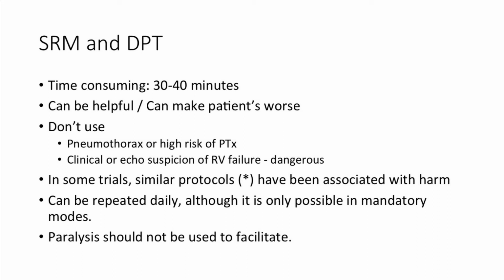You can do it daily, but as I said, it takes quite a long time. It's only really possible in mandatory modes, and like I said earlier, we're trying to progress people as quickly as you can to a spontaneous breathing mode. If you're having to paralyse people to do it, then it's probably not worth doing. You're probably doing more harm than good.